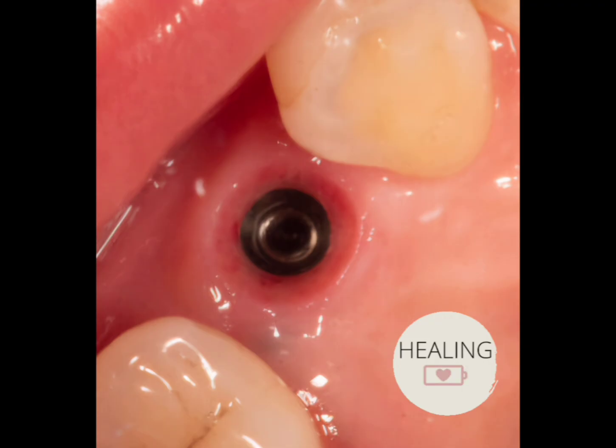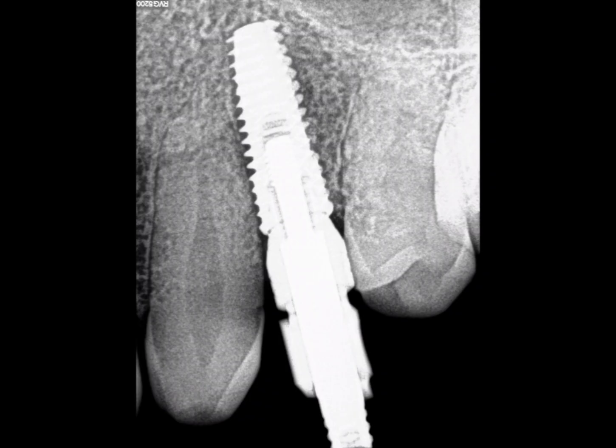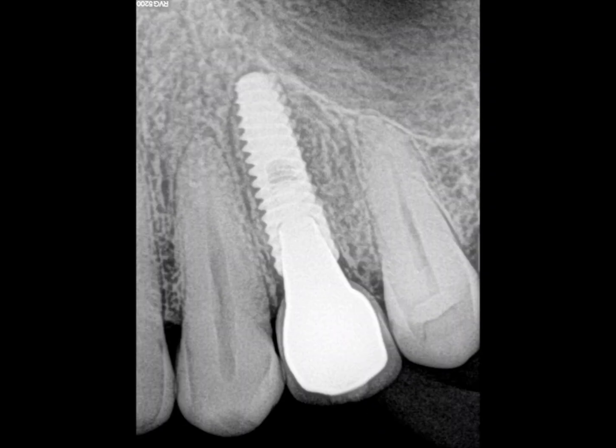Prosthetic phase. After another 15 days, healthy peri-implant soft tissue was observed. The healing abutment was removed. An impression coping was placed and an IOPA was taken to verify complete seating. An open tray impression was used to obtain an accurate implant level impression. The impression was then sent to the laboratory for fabrication of the definitive prosthesis.